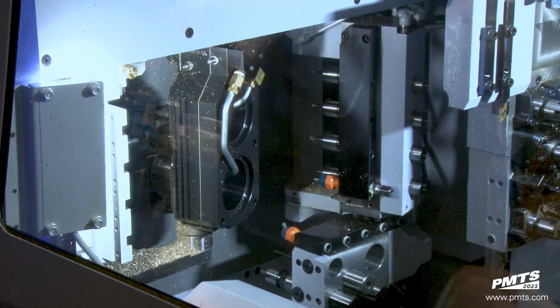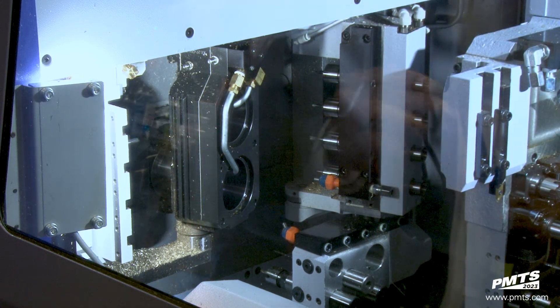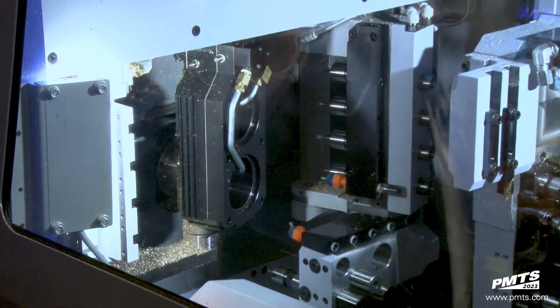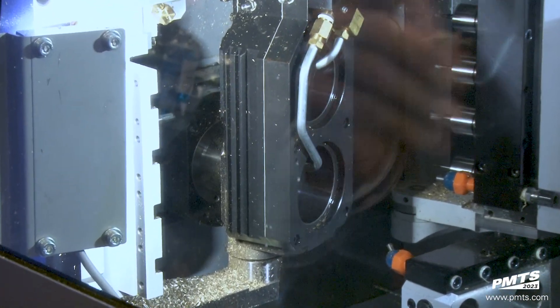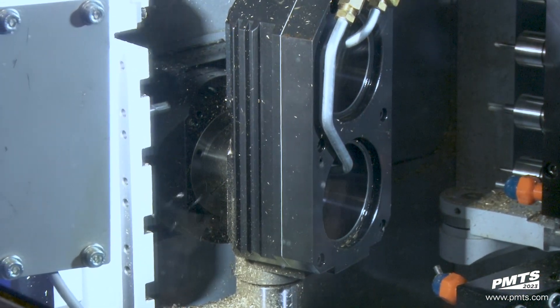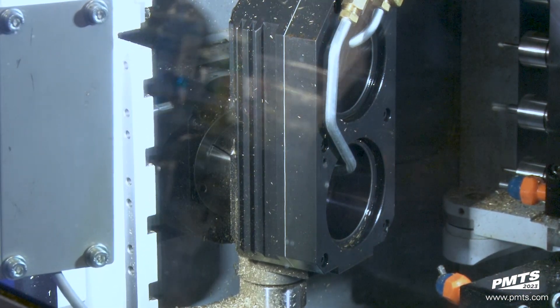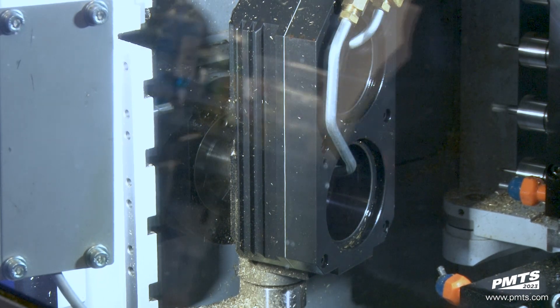With the SD26, we were able to tool up the back slide, especially when you're making an orthopedic screw — a spinal screw especially — where it has a lot of detail on the head. The added tool positions on the back side are enabling us to utilize the back side to get as much free work as possible on these more complicated spinal screws.